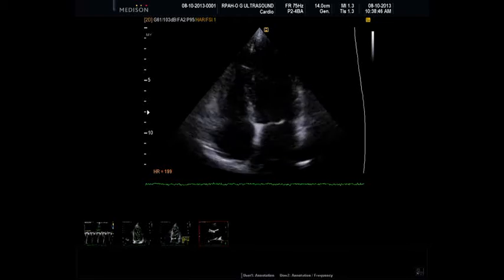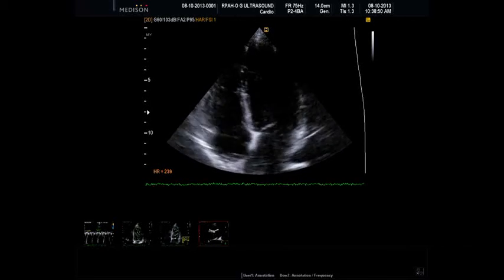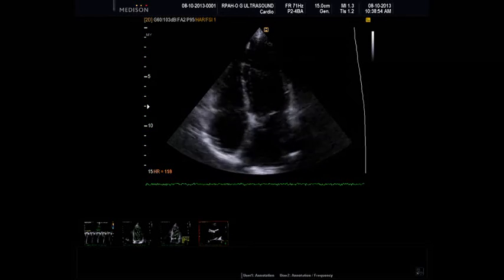Sometimes you find yourself hanging off your patient's ribs, so it can be a bit uncomfortable for them. And in pregnant women, their breasts get quite sensitive, so we just have to be quite careful.